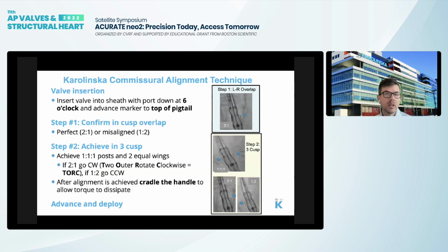We developed a technique together with a company and also with other centers. It has already been proposed that the insertion of the valve should be with the flush port down at 6 o'clock. With other systems, they have other proposals of the initial position. You will see in the end how much this helps.